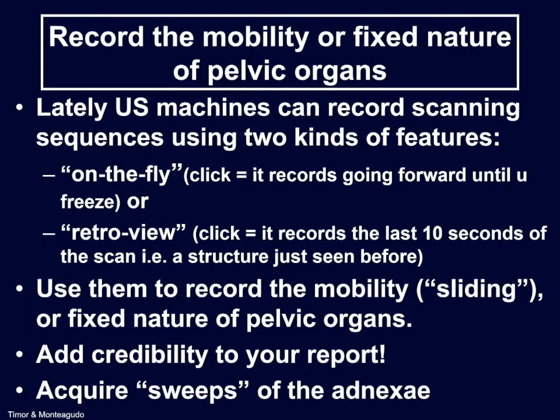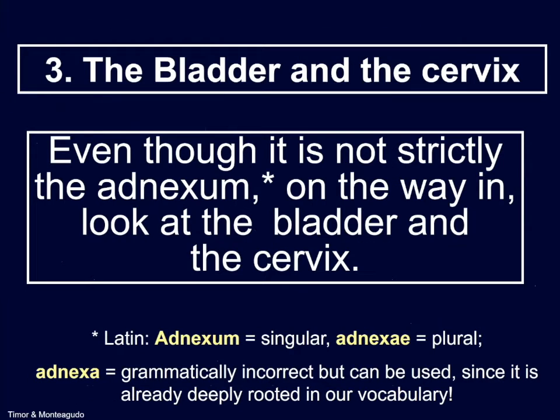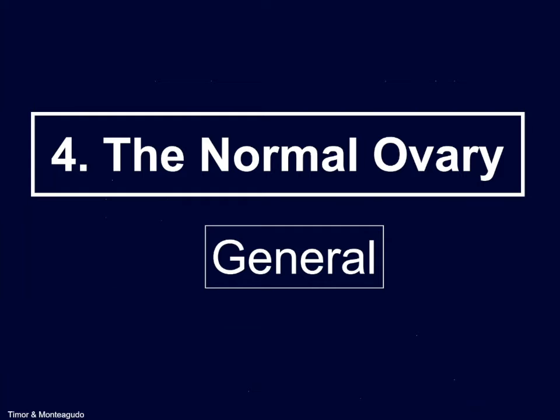Acquire also sweeps of the adnexae that you can review later for maybe missed structures. Before you do the actual scan, even though it's not strictly the adnexum, on the way in, look at the bladder and the cervix. By the way, adnexum is singular and adnexae is plural.